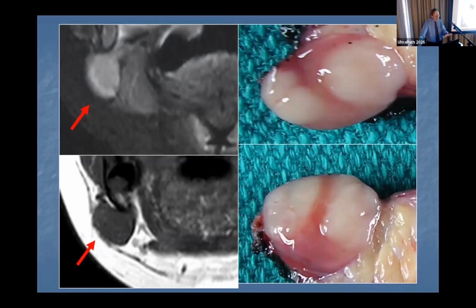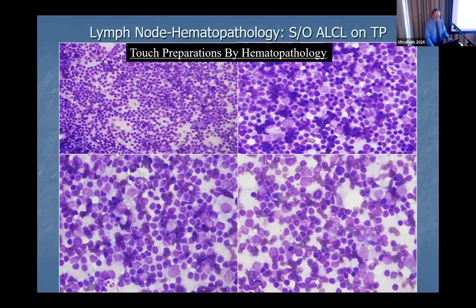And this is the imaging that I've blown up for you. That's the area that looked like it was probably a lymph node of some kind. And this is the tissue that we had available for biopsy. Looking at this, it has a very fleshy appearance, which could fit into a lymphoma family or other soft tissue tumor.